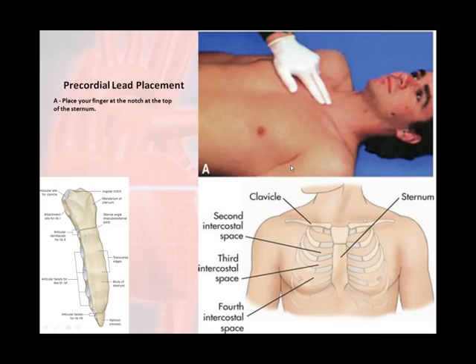So we're going to go ahead and discuss placement. Now, it's very important that you follow the proper placement procedures. And a lot of people ask me in the past, do you actually put these electrodes exactly where you're supposed to? And my answer is, if it's possible for me to place these electrodes exactly where they're supposed to go, I do it every single time.